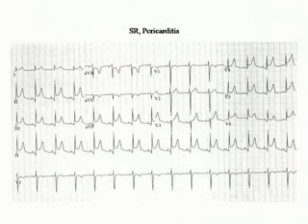The other thing about pericarditis is that the contour of the ST segment stays normal. It keeps that saddle-shaped contour, whereas ischemic injury tends to kind of blow the ST segment up into the T wave, whereas with pericarditis we keep our normal saddle shape or contour. And you see here we've got ST segment elevation in 1, 2, and 3.